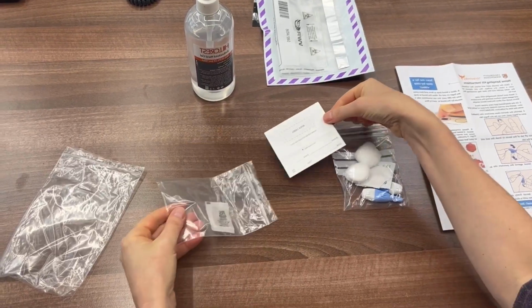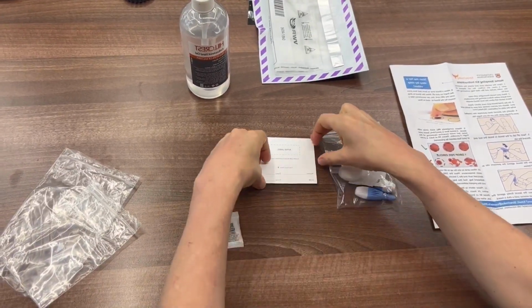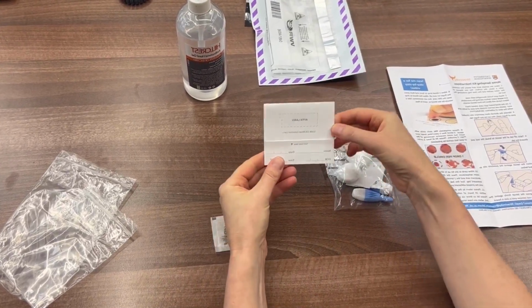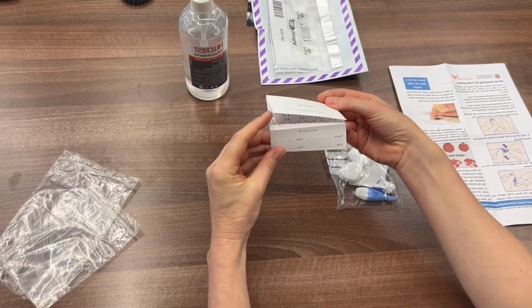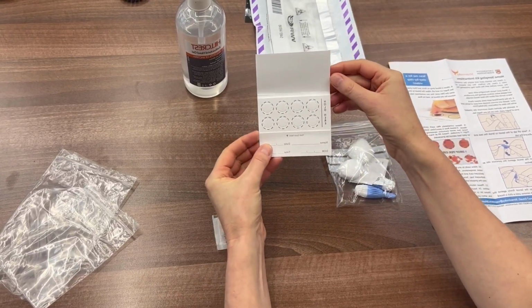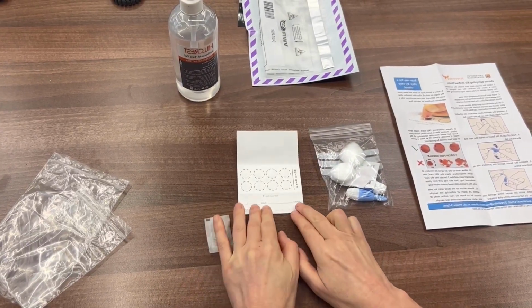So this is the dried blood spot card. We will have a barcode on here and your details. What you do is open it up so that you can see all the spots, and we put that down.